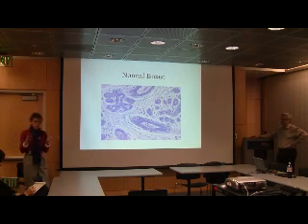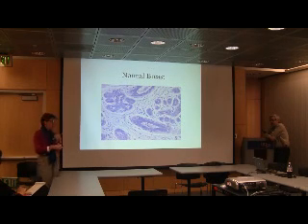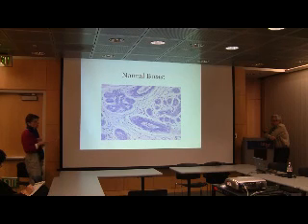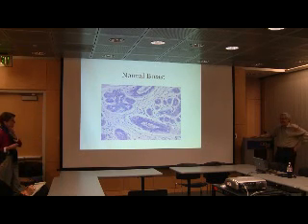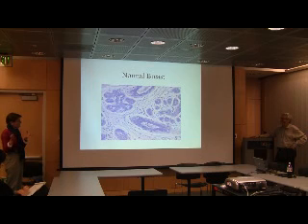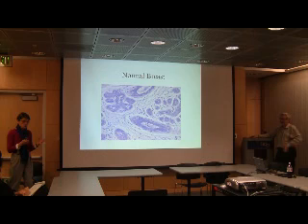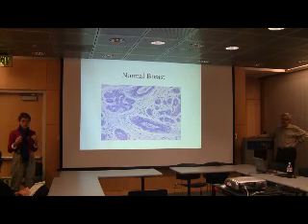But part of the process when you go through all this handling of the tissue is that you get shrinkage artifacts. So things that used to be together shrink a little bit, so you get gaps like between the duct and the surrounding stromal tissue. And so that's something that we expect to see. When I look at a slide, I don't even think about it, and it's good that you brought it up, because I'm so used to this artifact. When we look at tissue, we really are looking at a bunch of artifacts that we have learned what they mean.